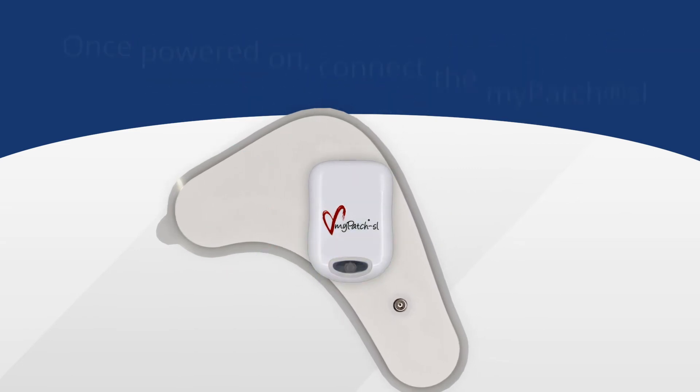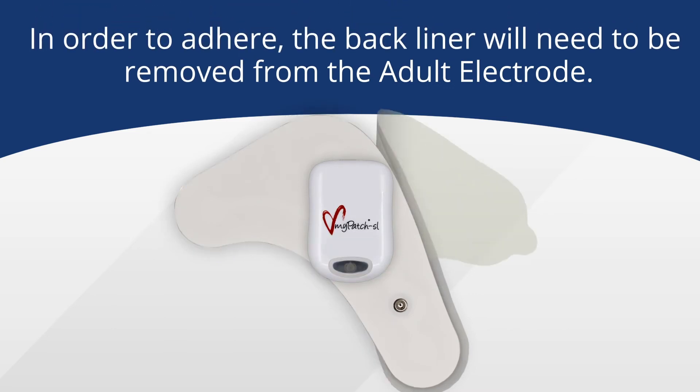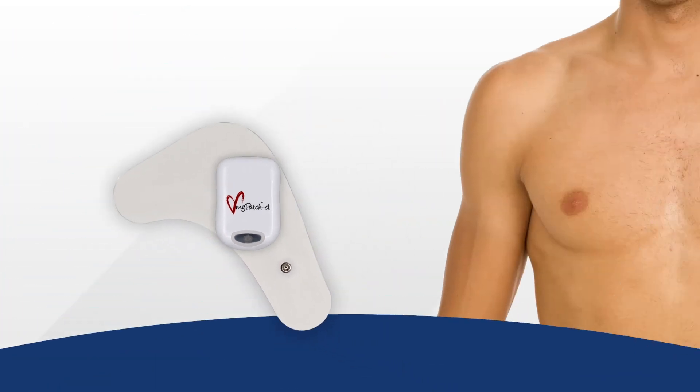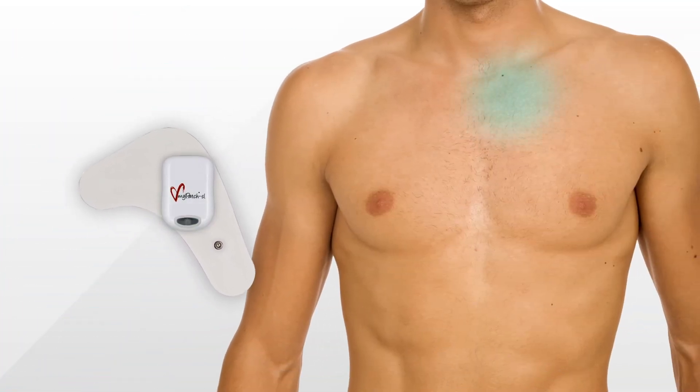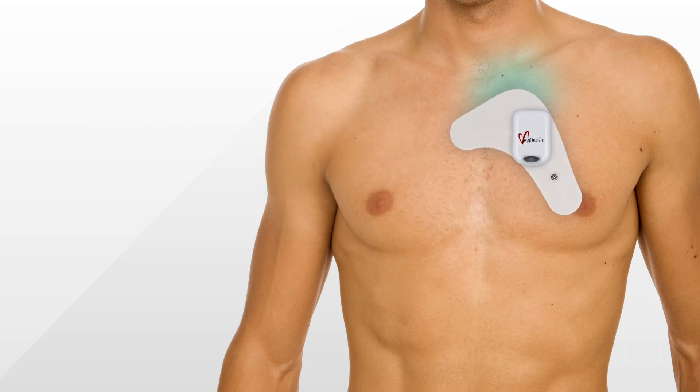After the MyPatch SL recorder and electrode have been connected, you're ready to put the device on the patient. Remove the back liner from the electrode. When applying, it's important to note that the recorder needs to be straight up and down. Now measure by placing two fingers below the sternal notch. The electrode should just cross the sternum on the right side of the patient's chest. Press the electrode down on the skin, remembering to keep the recorder straight up and down, and press firmly over the entire electrode to make sure it has adhered to the skin.